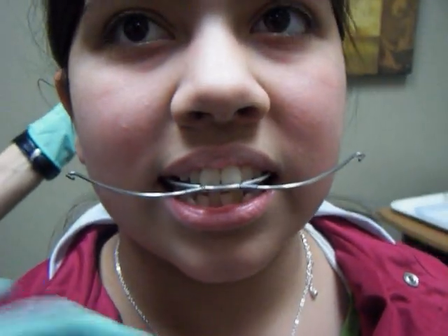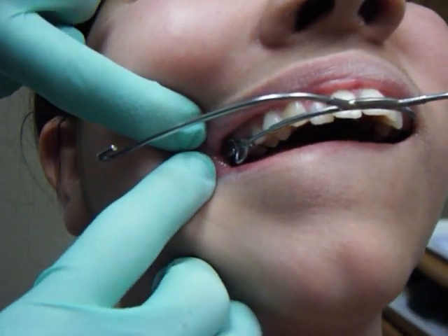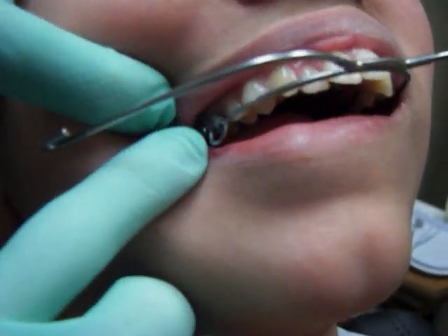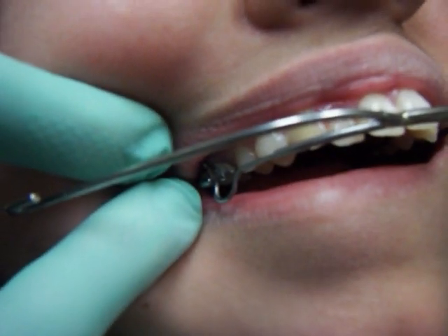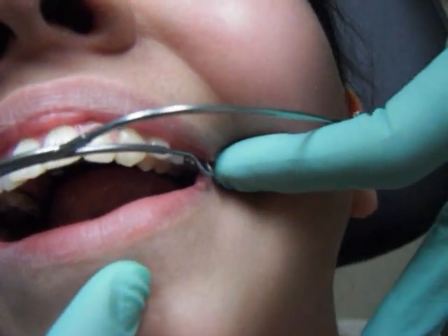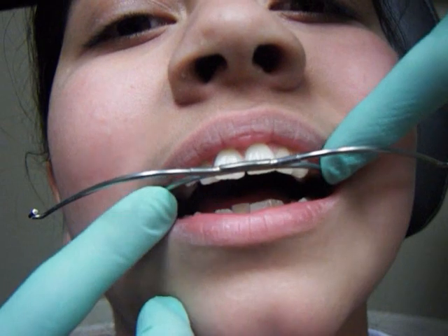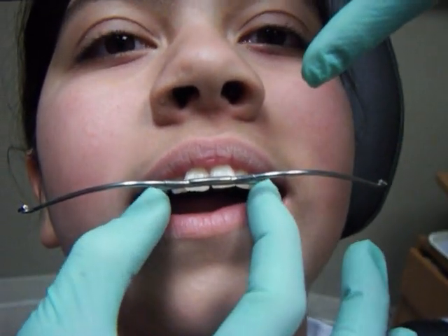Good. So now, if you could just rest your head back before you put that part on — just rest on the pillow behind you. I'm going to show everybody where that went. We can see how that prong went into this tube on the molar band here, and then the same thing on this side. This is called the outer bow, and this is the inner bow — that's locked into her upper teeth.